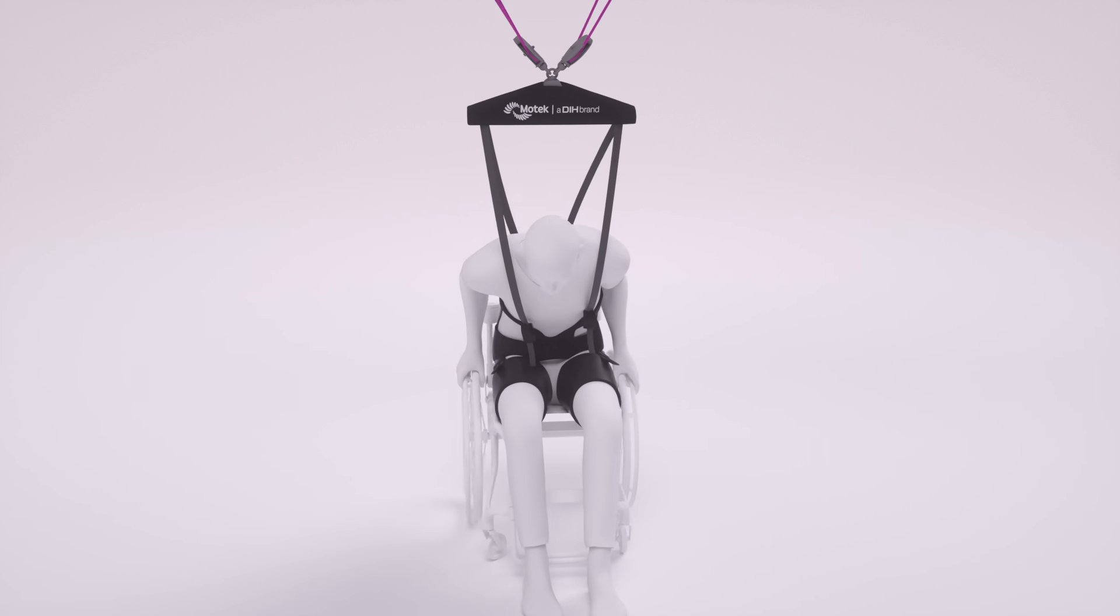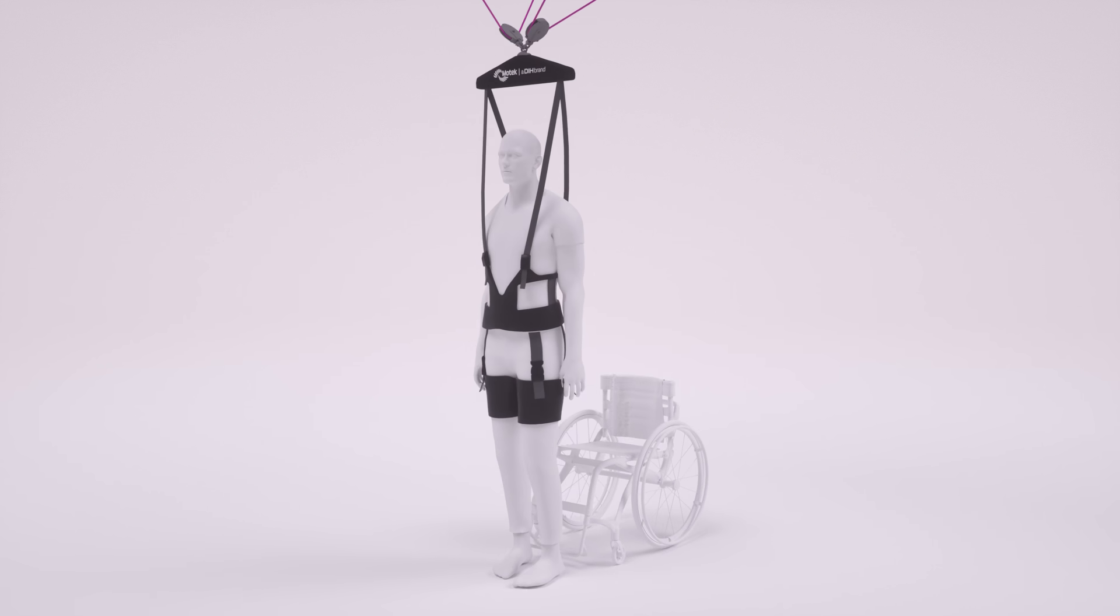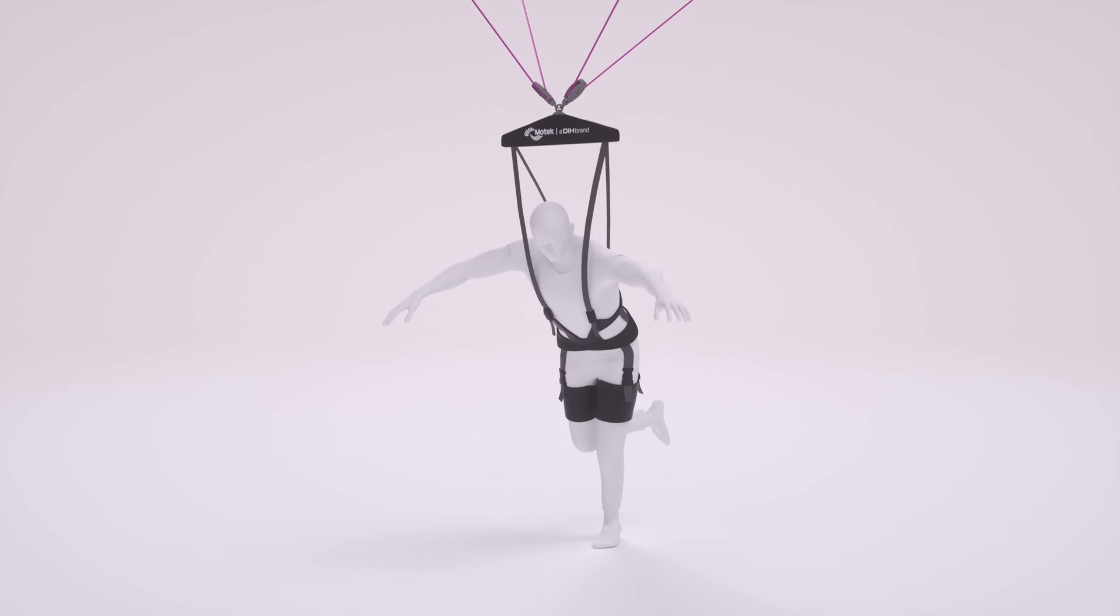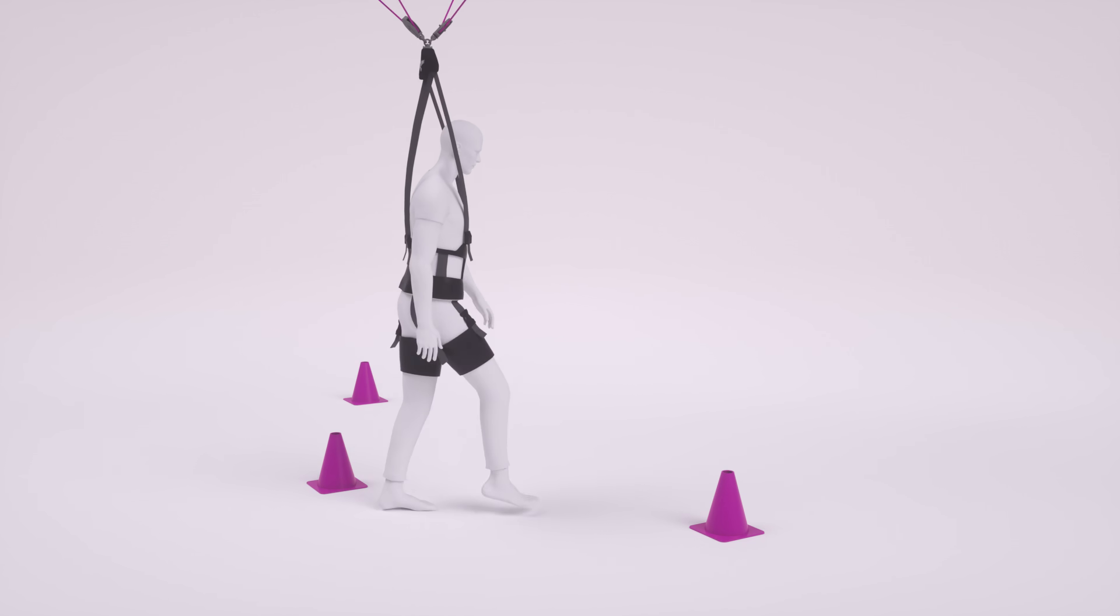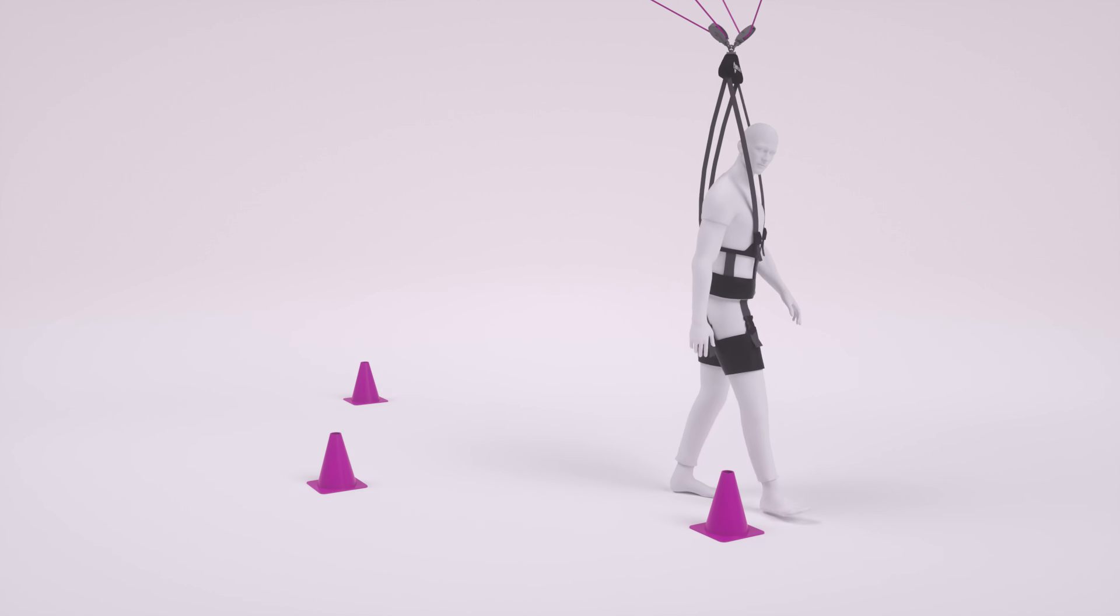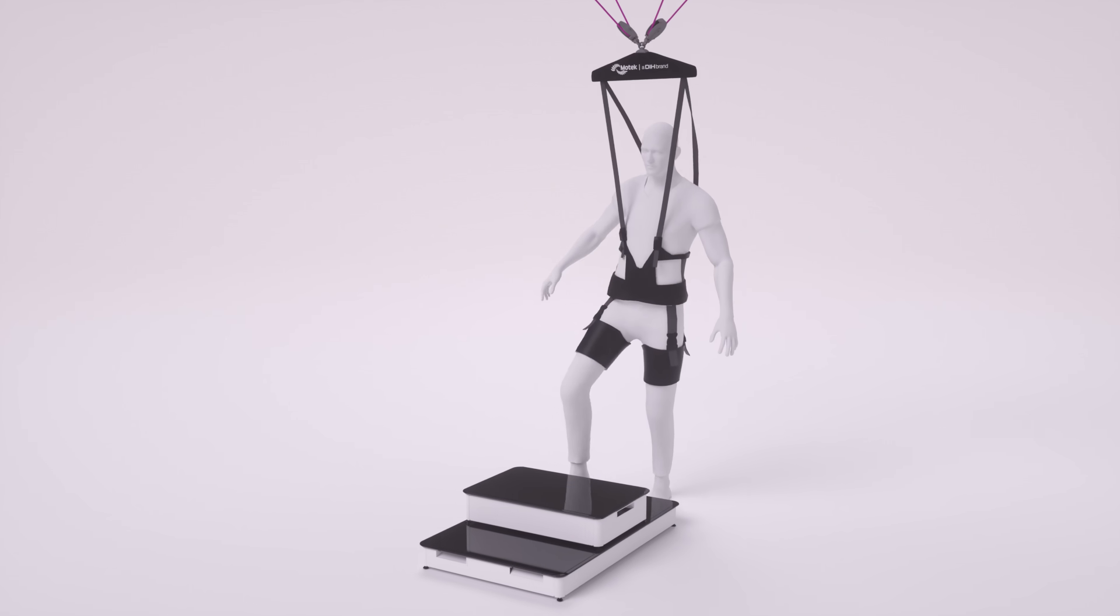This includes everything from sit to stand, balance, walking, turning, obstacle avoidance, and climbing stairs.